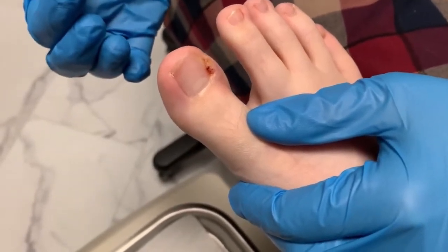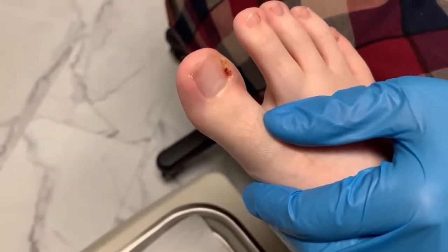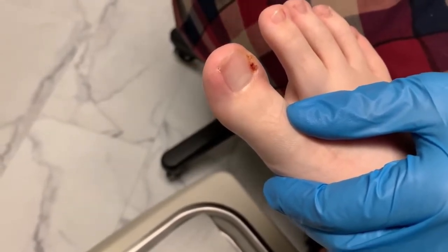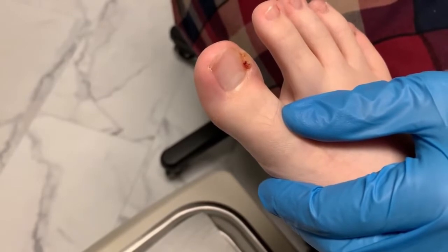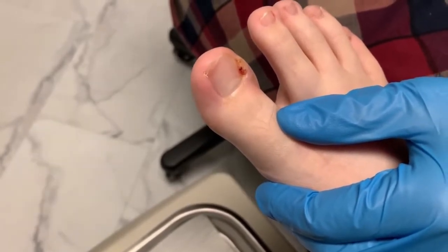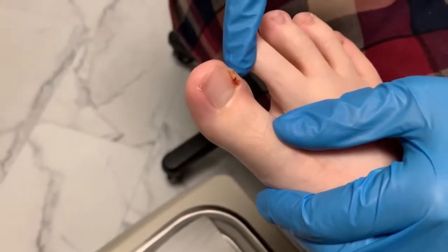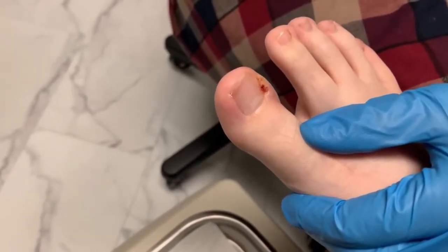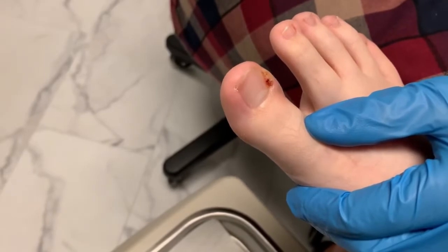What silver nitrate is going to do is cauterize it. If you have any animals, like specifically dogs, and you're trimming their toenails and clip a little too close and it bleeds — silver nitrate is what they use to stop the bleeding in that area. Basically the same thing. The silver nitrate is going to allow that granuloma to retract back much quicker so we can get back to a healthy looking toenail.